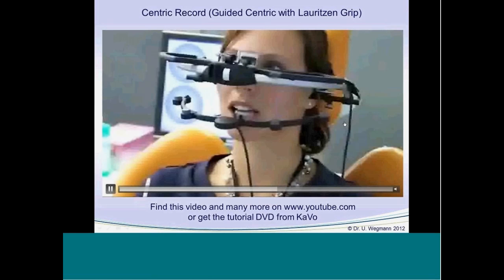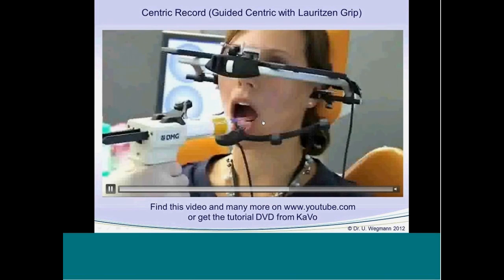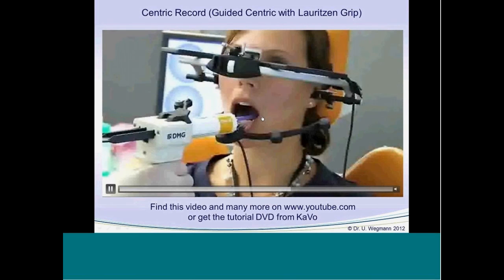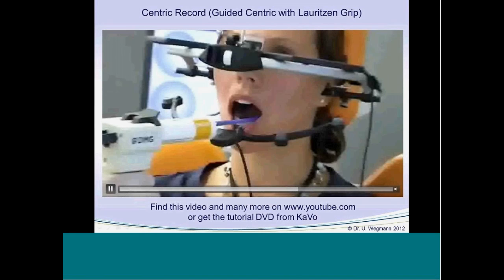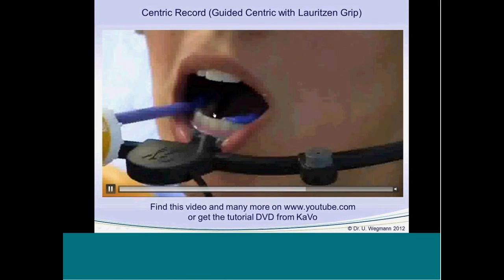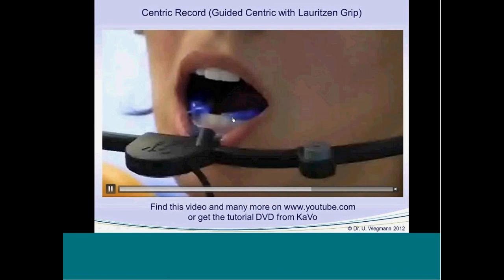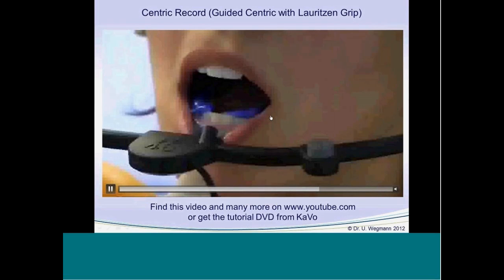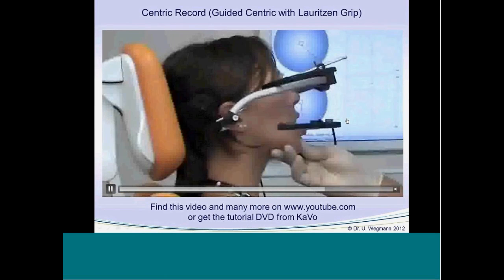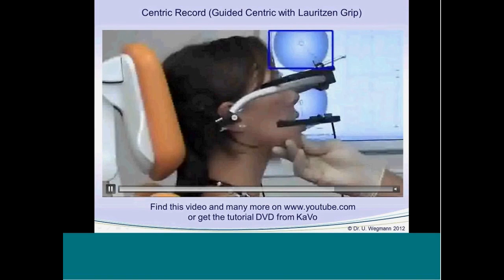When we have done it, we add some registration material into the teeth. And then we guide the patient back in the same position as before until the material is set. That means we can start the measurement again. We have the fixed position from the first time we did in the Centric Record, and now we bring back the patient in the same position.